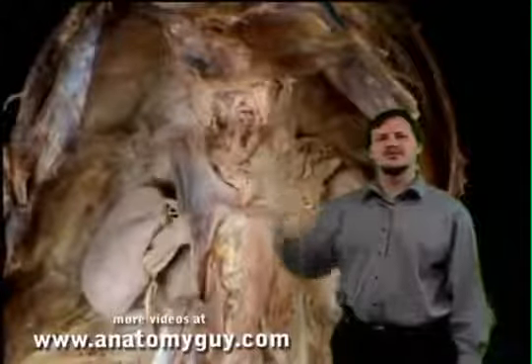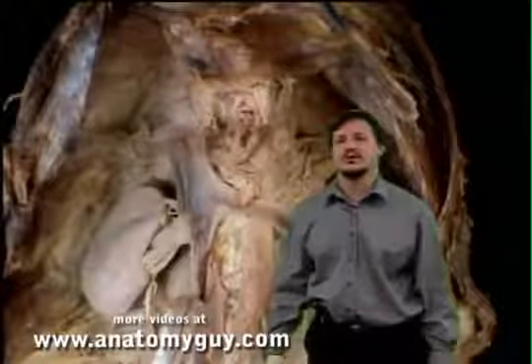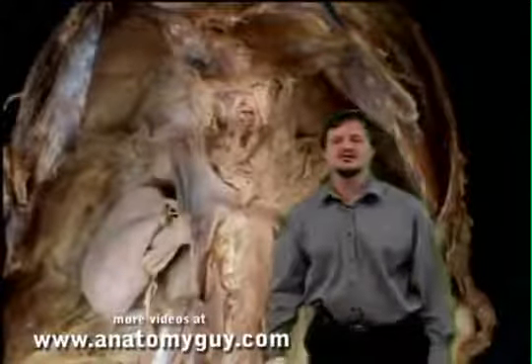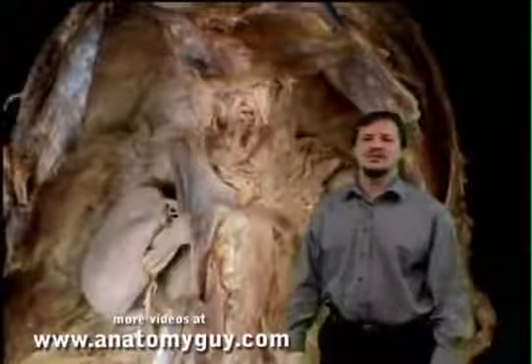Remember, the aorta in the abdominal side is going to begin after it passes behind the thoracic diaphragm at the level of T12 vertebrae. We can even see the esophagus right in here that's passing through the diaphragm in the crus at the T10 level. The IVC would be going through at T8. Now let's zoom in a little bit more and look at some of the branches of the aorta.